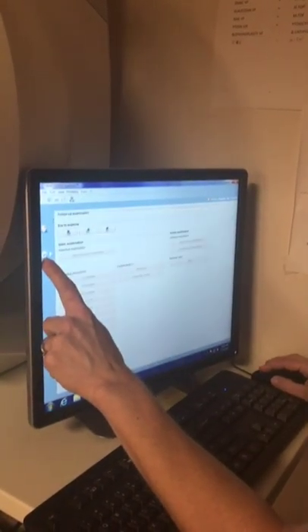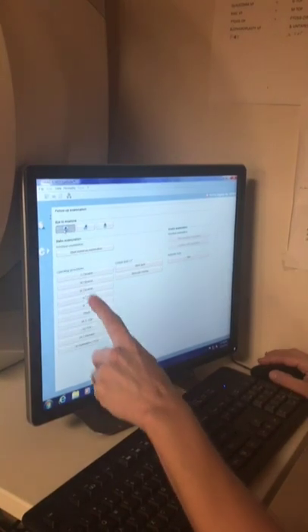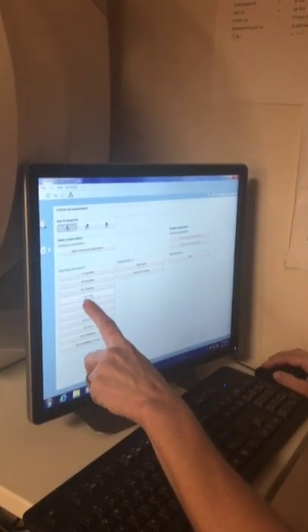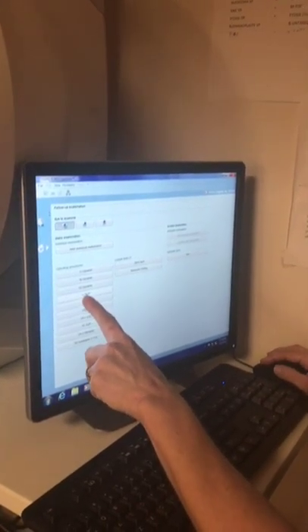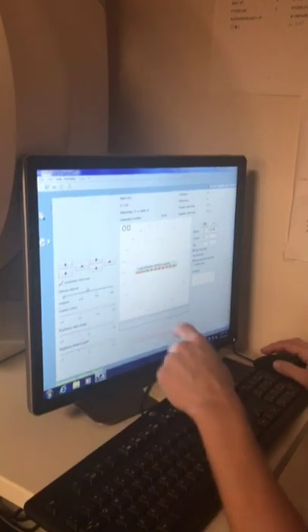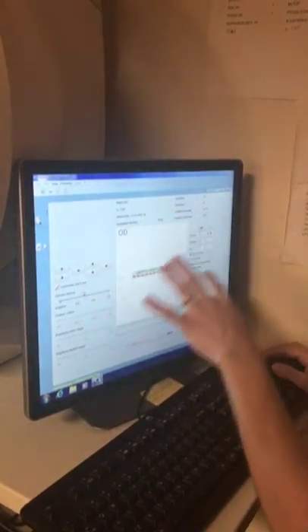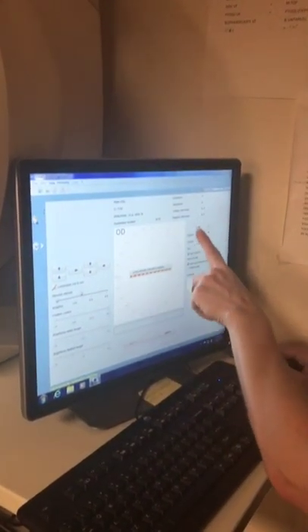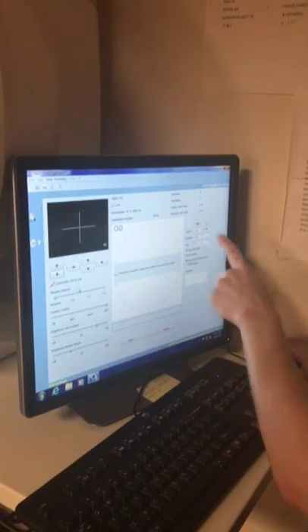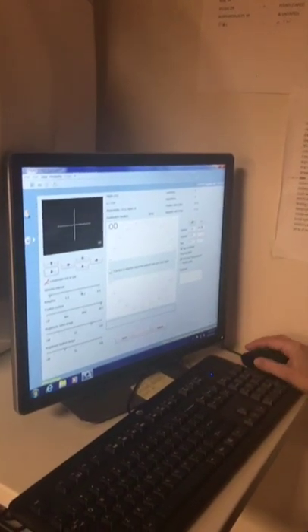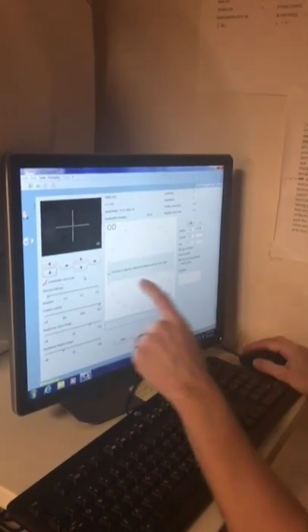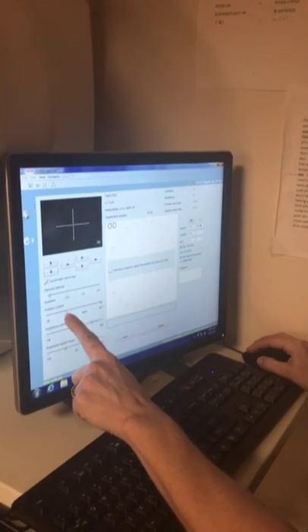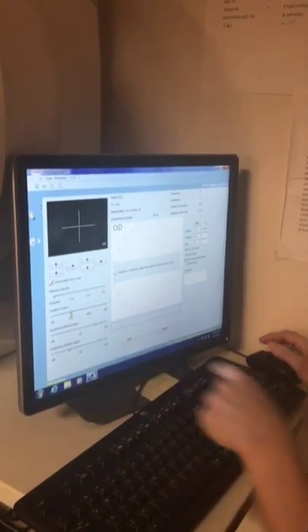Now we're going to pick the right eye and we're going to say that the doctor ordered the G top. They should give you that information also. So G top, and then we've got our testing screen. This is the prescription we put in, this is the lens that we need. The lenses are behind you. Before you start the test, you want to bring fixation control down to minimum and then you want to tell the patient to put the patch on their left eye.